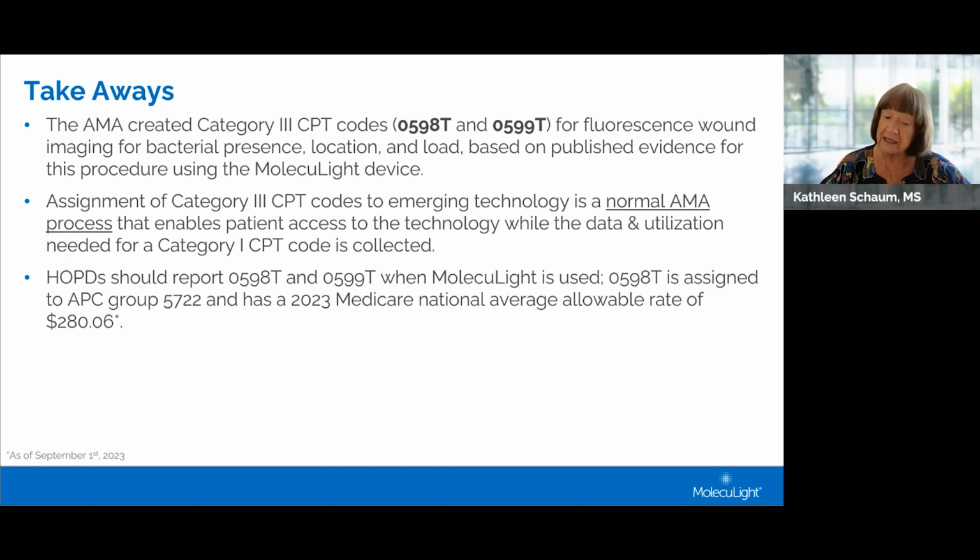And as we discussed, payment for CPT code 0599T is packaged into the payment of CPT code 0598T and does not have a separate OPPS payment. Now, physicians and QHPs also report 0598T and 0599T when they use MolecuLight in the HOPD.